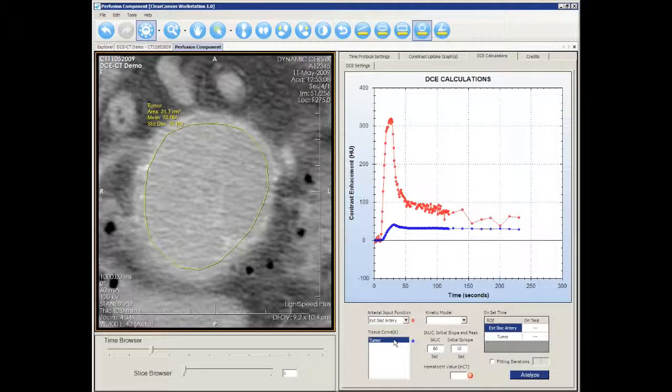There are two published kinetic models that you can use, and the DCE tool will automatically generate a semi-quantitative analysis of your study regardless of which kinetic model you select. We will select the modified TOFTs model.